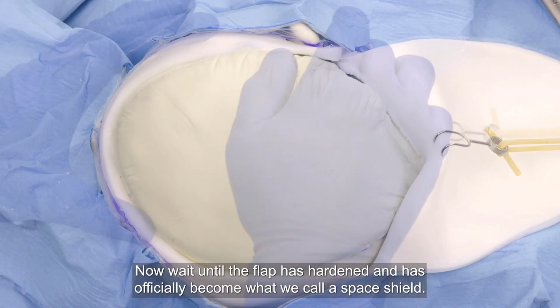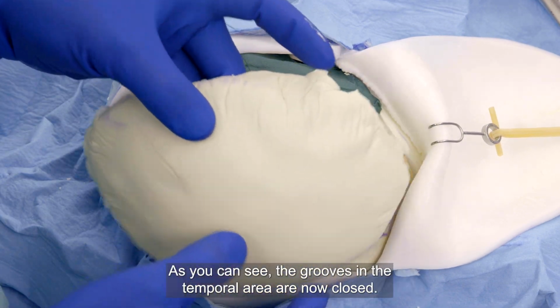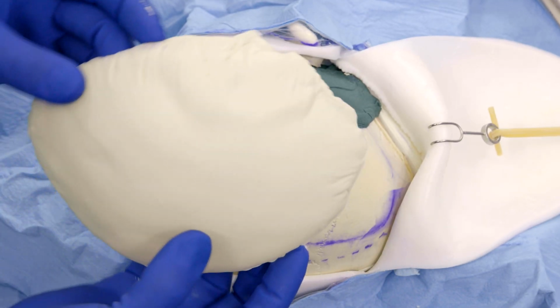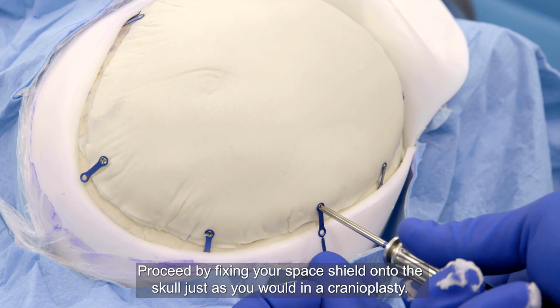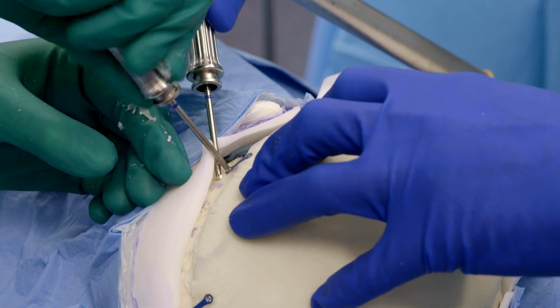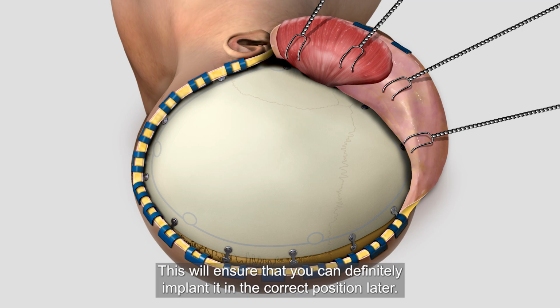Now wait until the flap is hardened and has officially become what we call a space shield. As you can see, the grooves in the temporal area are now closed. Proceed by fixing your space shield onto the skull just as you would in a cranioplasty. This will ensure that you can definitely implant it in the correct position later.